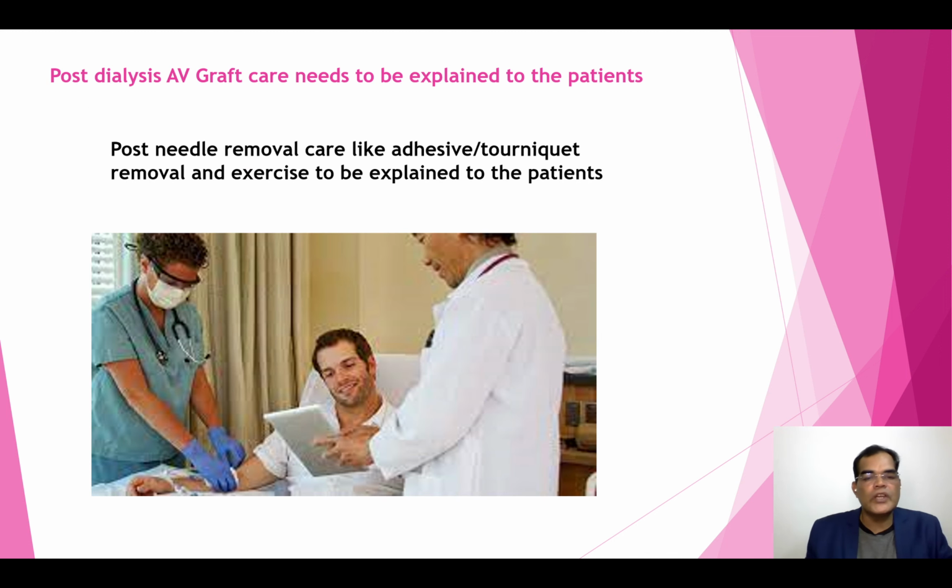Post-dialysis care needs to be explained to the patient: when to remove the plaster, how to handle it, and whether exercise needs to be done or not after the day of dialysis and removal of needle. Normally, it's recommended not to do any exercise, or lift, or disturb the hand much. This needs to be explained to the patients. Post needle removal care is very, very important.